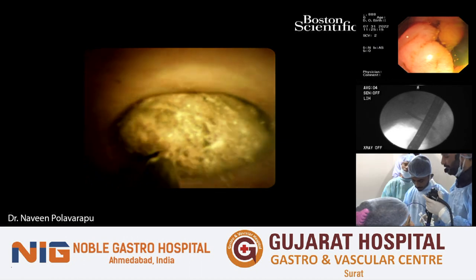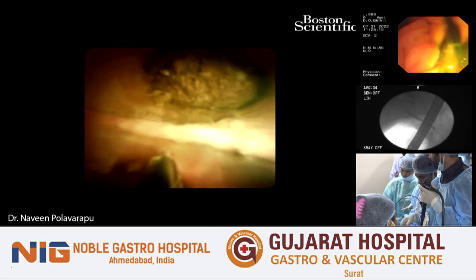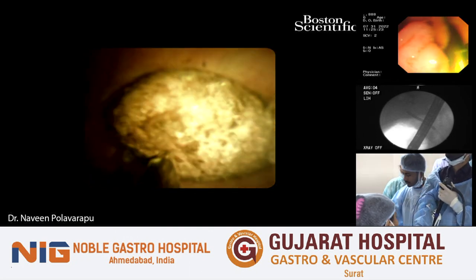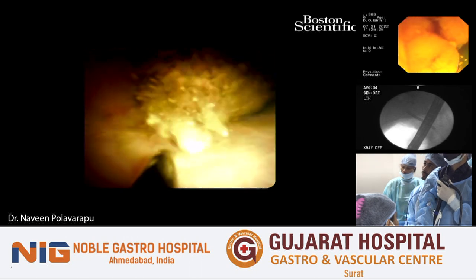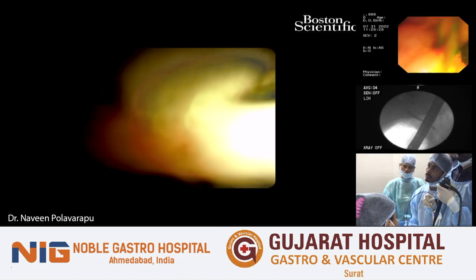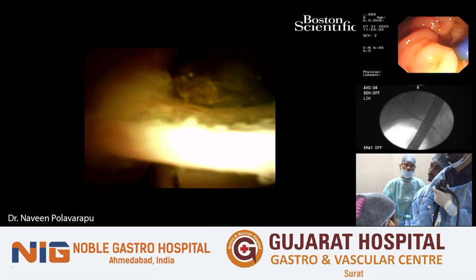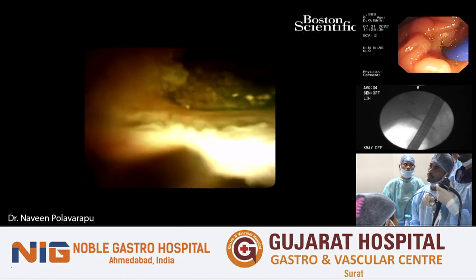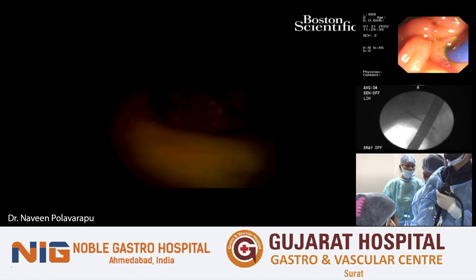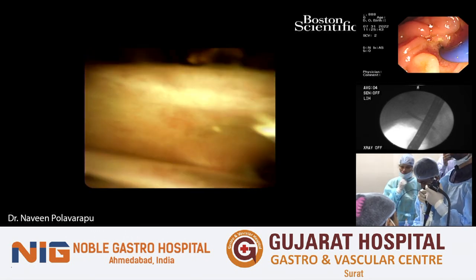Ready? Ready to fire? What settings we got now? Low 3. Yeah. Okay. Perfect. Do you think that apnea will help in this? Yeah, absolutely. That definitely will help because as you can see with even minor movements of his breathing, you can see there's a significant change in the views that we're having in the spy scope. So, can anesthetist do some apnea for a moment?